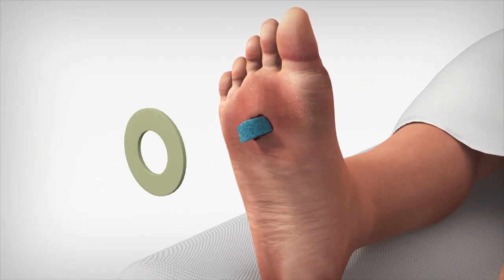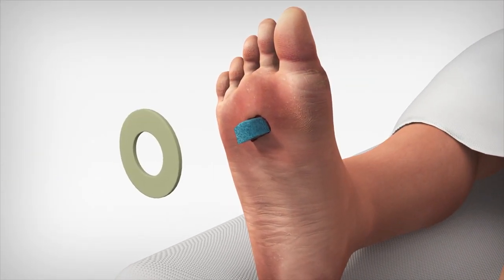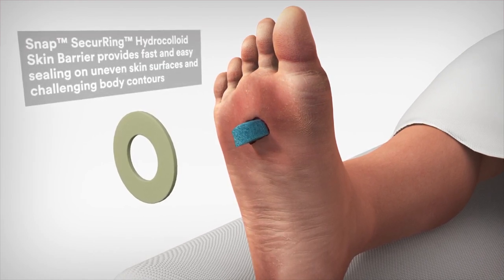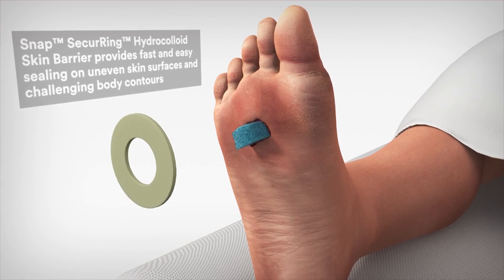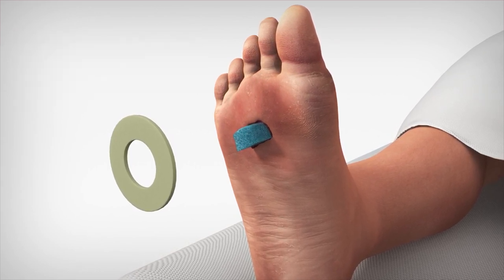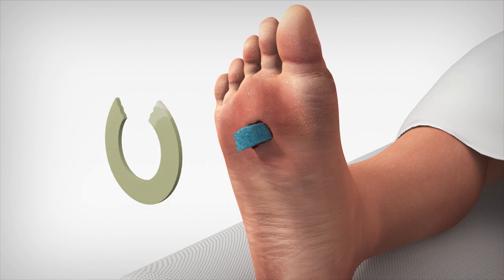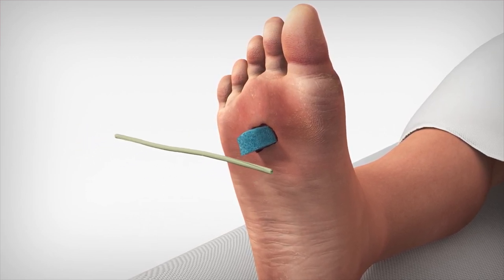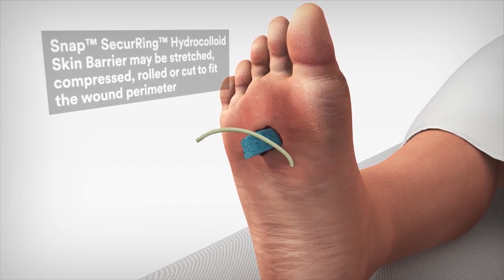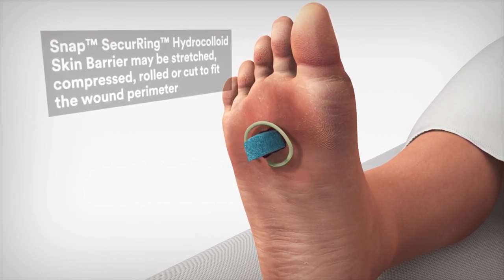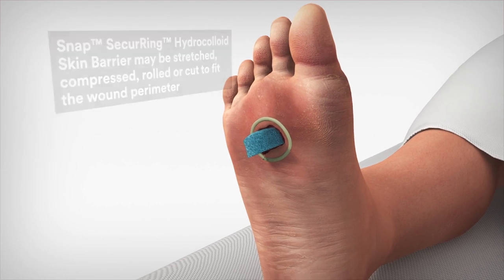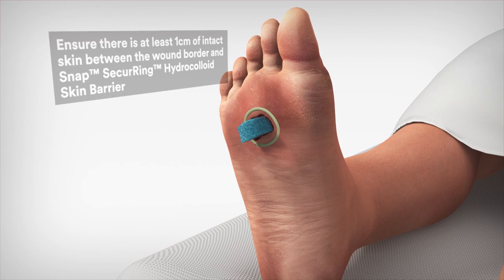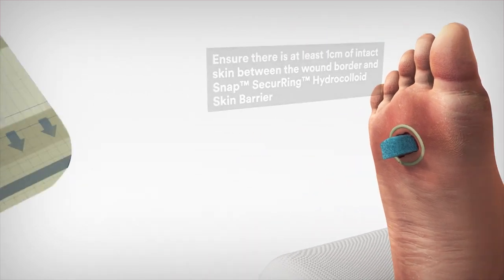To help create a seal, the SNAP securing hydrocolloid skin barrier may be utilized. This is a sterile moldable hydrocolloid ring designed to provide fast and easy sealing on uneven skin surfaces and challenging body contours. Before applying the SNAP securing hydrocolloid skin barrier, be sure the skin is clean and dry. Shape the hydrocolloid to fit around the outside of the patient's wound. Using light pressure, apply the SNAP securing hydrocolloid skin barrier around the wound. Do not place the hydrocolloid directly into the wound.